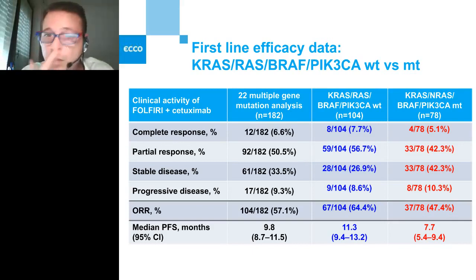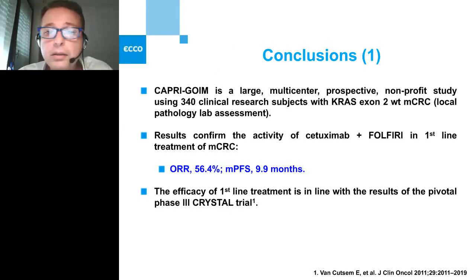More importantly, we have clearly demonstrated that molecular profiling of colon carcinoma by using the AmpliSeq colon and lung cancer panel is feasible on FFPE tumor tissue. In particular, we received these 182 samples from many different surgical pathologies, over 20, and these samples were fixed, treated and handled in many different ways, but our panel showed to be highly robust, and in fact the analysis was successful in all the cases that we analyzed.